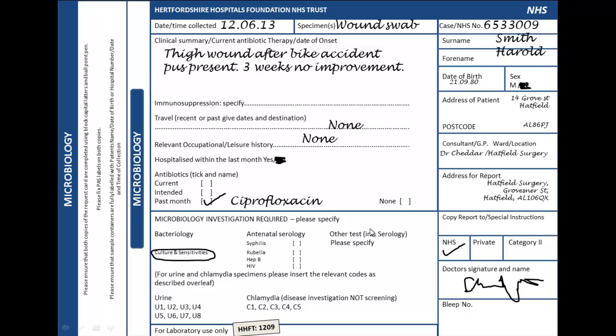We're going to quickly go through how an organism may be identified in a routine diagnostic laboratory. In front of us we have a specimen information form. We've got an imaginary patient called Harold Smith with all his details. In the clinical summary, he's got a thigh wound after a bike accident.